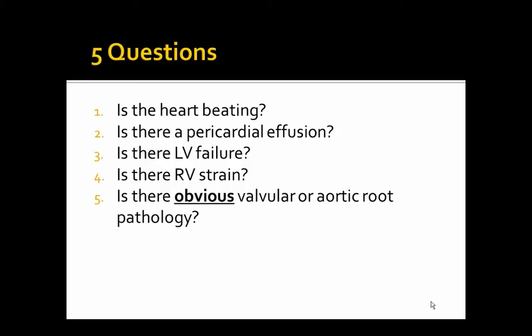So question number 1, is the heart beating? Number 2, is there pericardial effusion? Number 3, is there left ventricular failure or dysfunction? Number 4, is there right ventricular strain or dilation? And number 5, is there obvious, emphasize that word obvious, valvular or aortic root pathology?